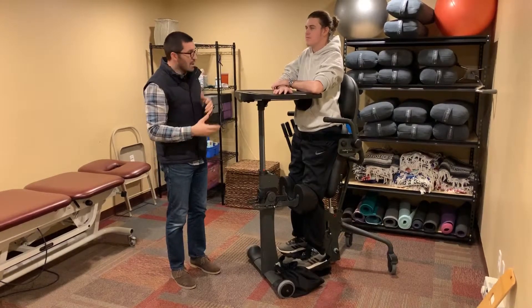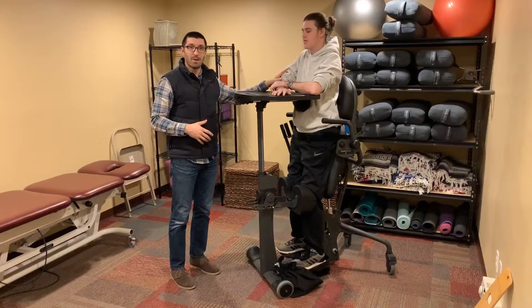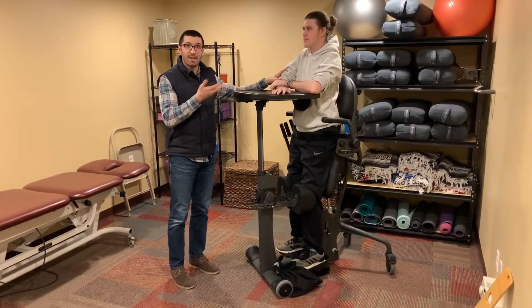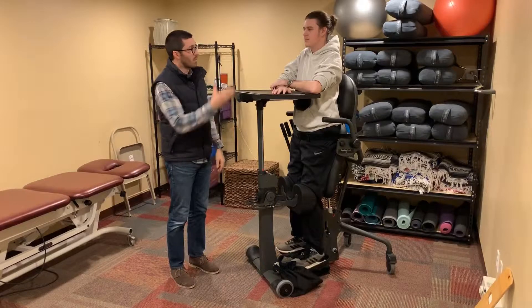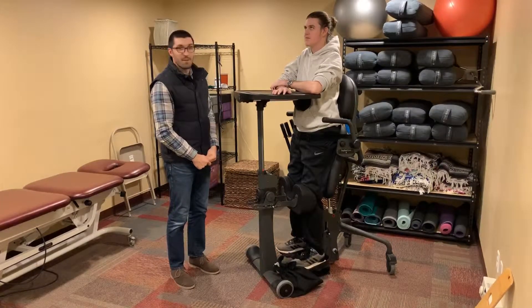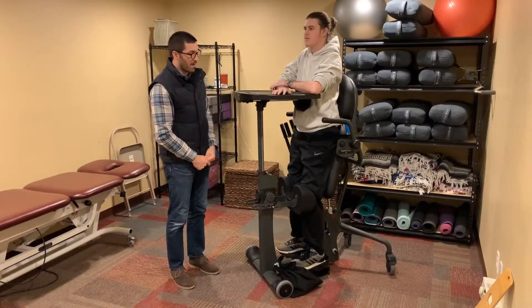Just remember that when you take someone with a higher level spinal cord injury into a standing position, they can experience orthostatic hypotension where blood kind of pools down in the lower extremities and makes it more difficult to get back up.